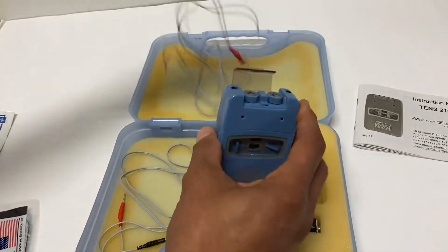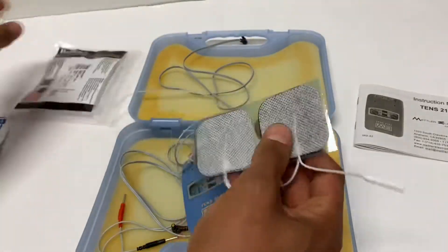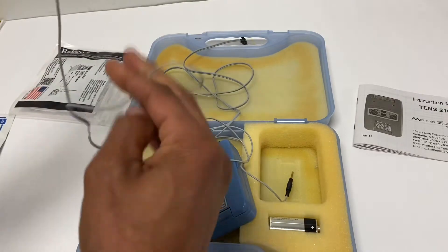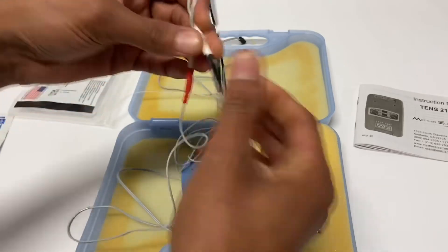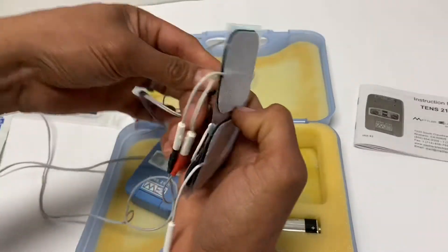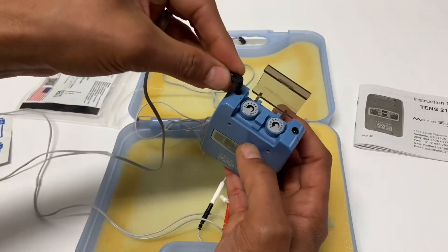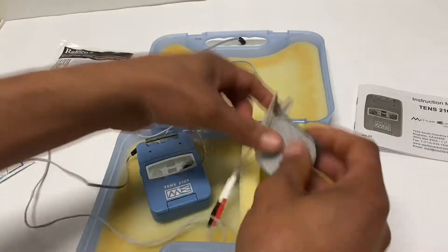Next we get ourselves some electrodes. Place these on here for each channel. With a TENS we have a red and a black — a positive and a negative — and we're going to need one for each channel. Different units function the positive and negative differently, but for the TENS they work together as one unit. Put that on and connect it to lead one, make sure that's securely in, then do the other side.